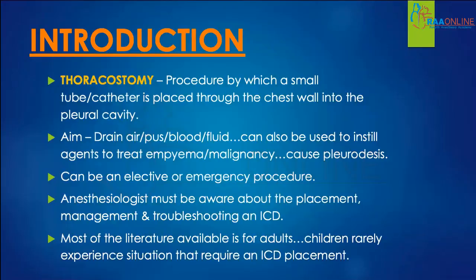The aim is to drain air, pus, blood, or fluid, and it can also be used to instill agents to treat empyema or malignancy, that is, with the intention of causing pleurodesis. Now, ICD insertion, as I was telling you, can happen in the ER, that is emergency room, in patients who have been victims of road traffic accidents or any trauma, or it can be elective procedures in the ORs or in the medical ICU.